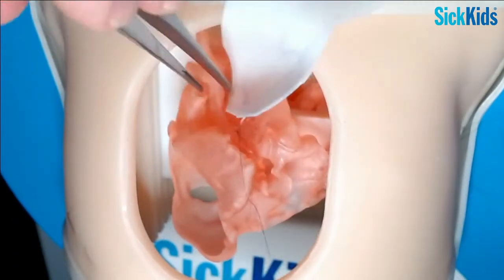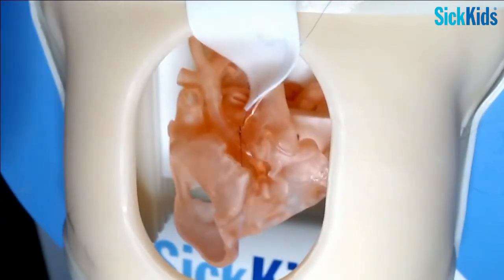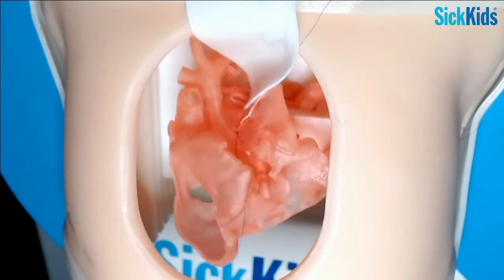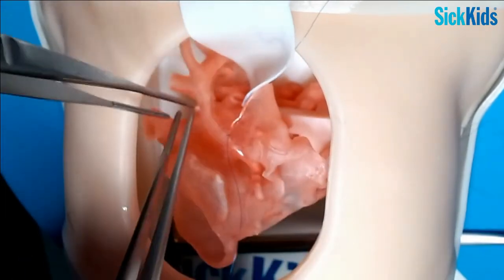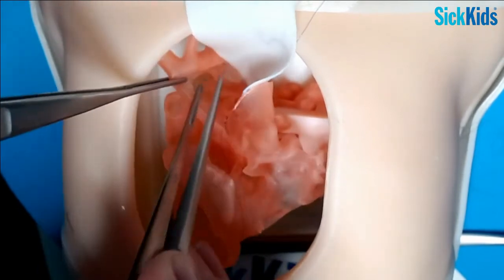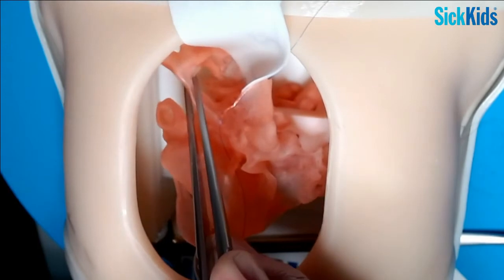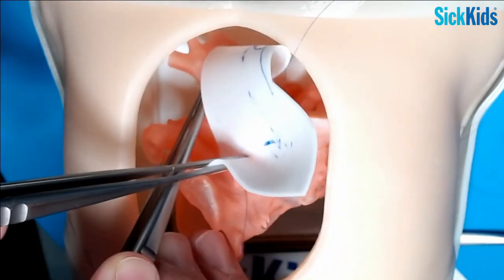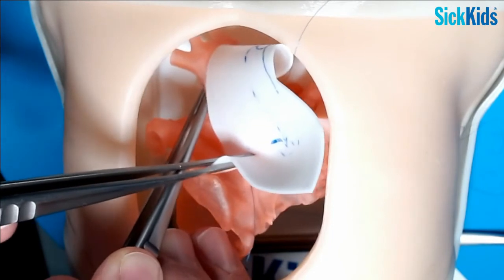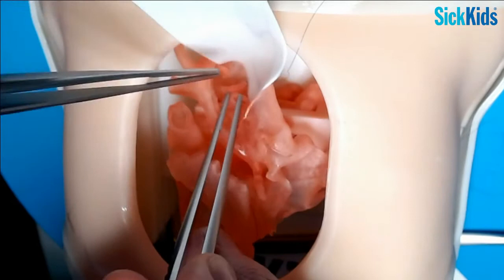Now, let's just look at this patch for a minute and think about it, because it's going to give you a chance to see how we work on this patch and why. So we've sewn the toe down. You can see that what we would need to reconstruct is this big long thing here. So that's a very, very long edge. And that's what it's going to fold over like that. See that? We could even mark that right now, that's where that cut's going to be.